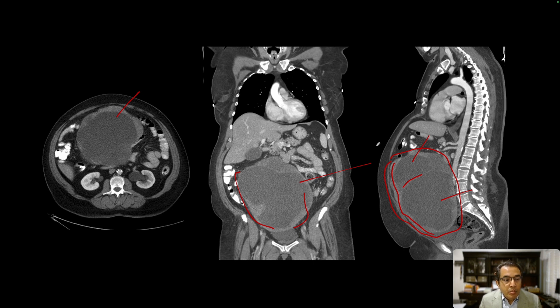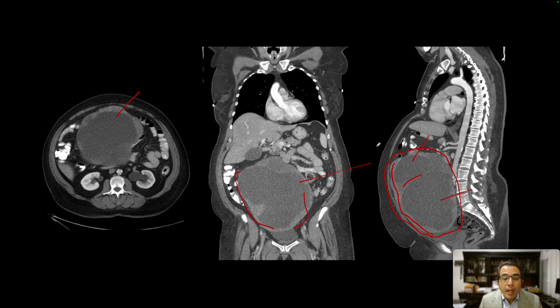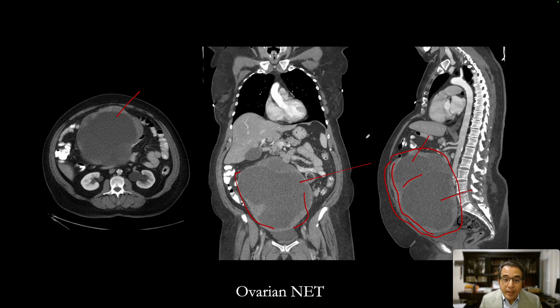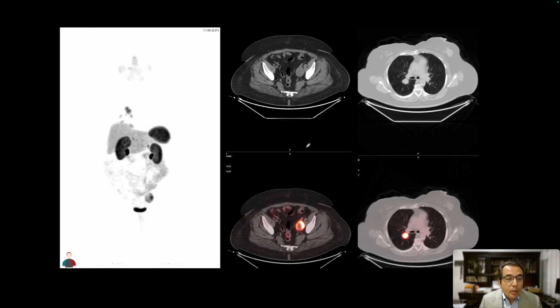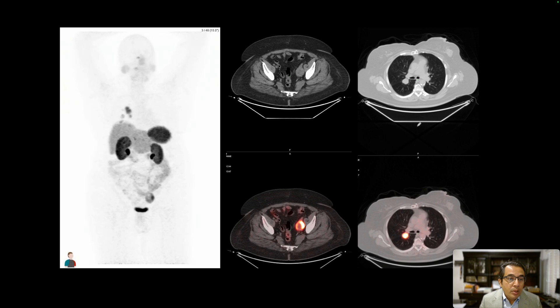They can become very large in size. This was diagnosed and resected, and it turned out to be a rare ovarian neuroendocrine tumor. The patient had surgery, and after that they presented with signs and symptoms of tumor recurrence.